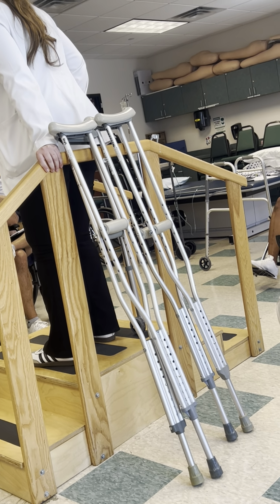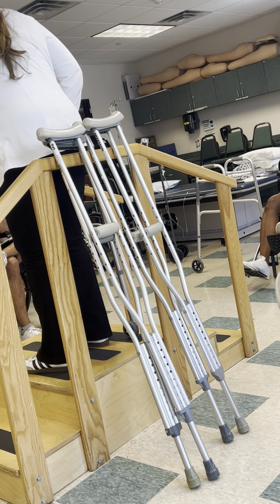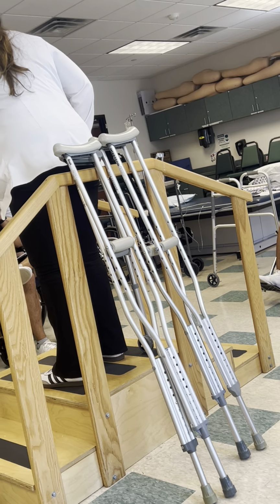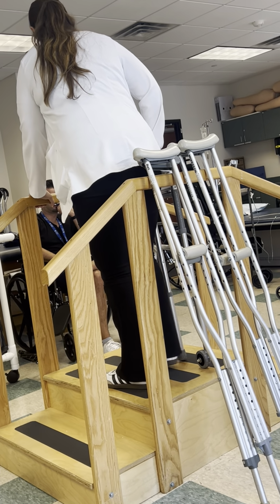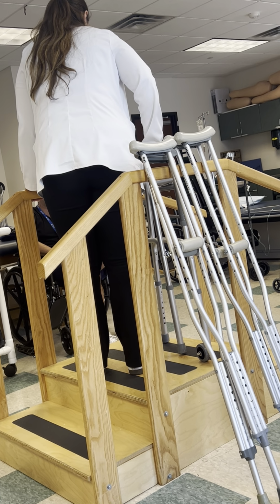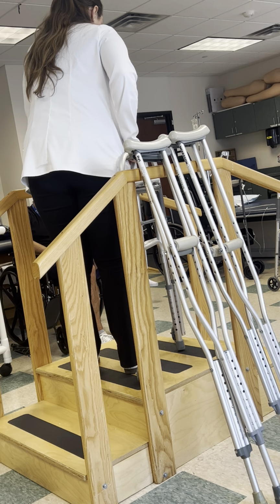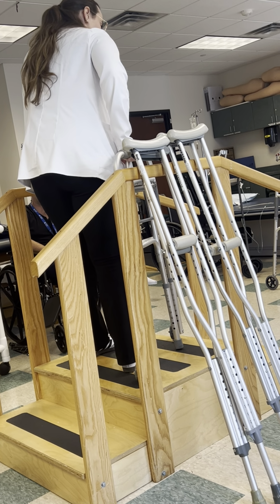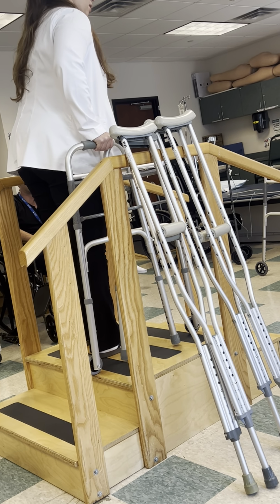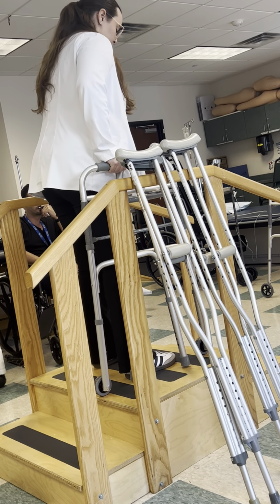Here is where the patient will need to switch from one handrail to the next handrail before taking any steps. Assistive device, involved, uninvolved, because I'm on a level surface. Assistive device, involved, uninvolved. Okay?